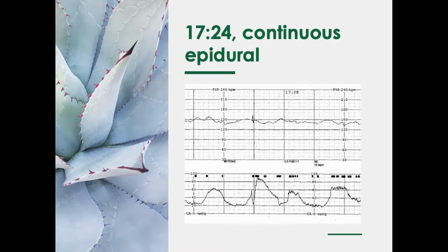She gets an epidural, and this is her fetal heart rate tracing following that. And we can see 145, 140 maybe for baseline. Are there accelerations? What's the definition of an acceleration? I'm hearing 15s. Okay, 15s, easy to remember, right? There is a 15 beat rise above baseline in the fetal heart rate lasting at least 15 seconds long. What does the presence of an acceleration tell you about the baby?